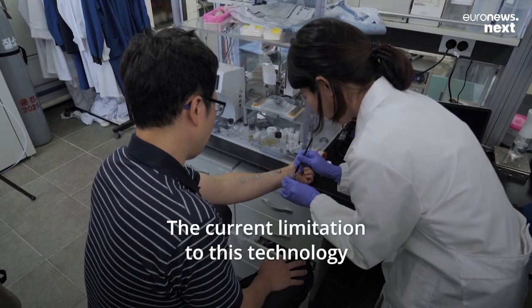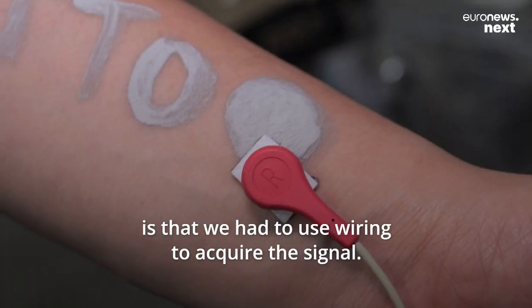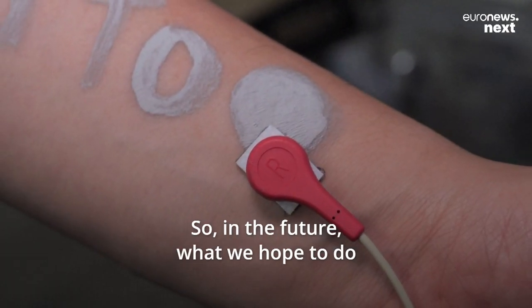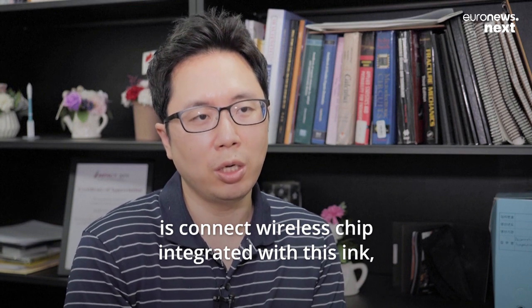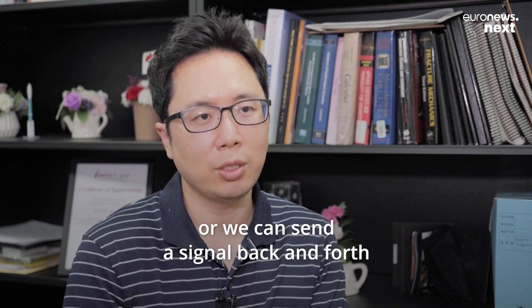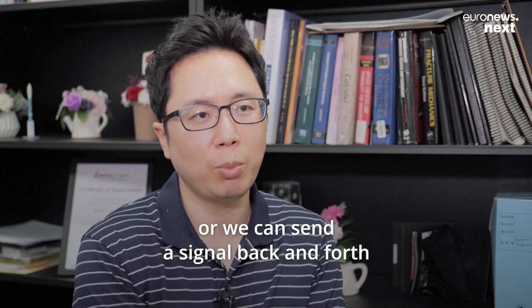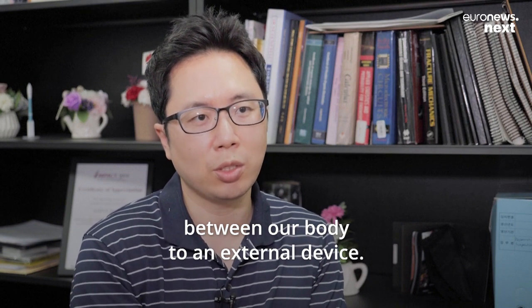The current limitation to this technology is that we had to use wiring to acquire the signal. So in the future, what we hope to do is connect a wireless chip integrated with this ink so that we can communicate, or we can send signals back and forth between our body and an external device.